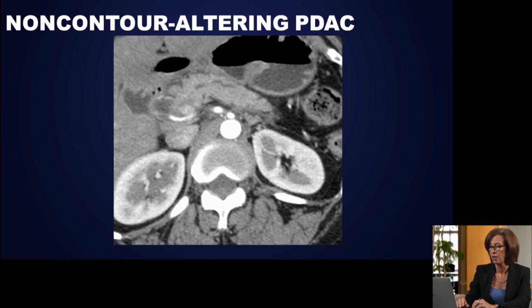We're going to step down through this patient's pancreas. You can see from the initial image that the duct is dilated, and we're looking for the tumor that we know must be there causing that duct to be obstructed.